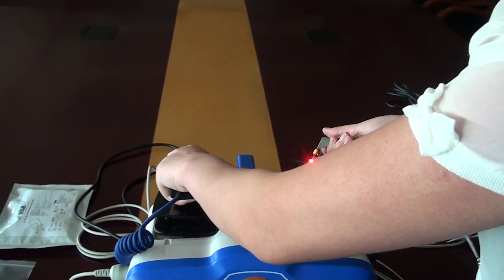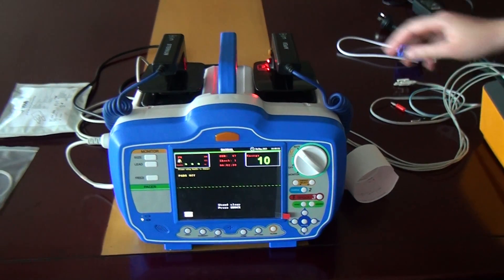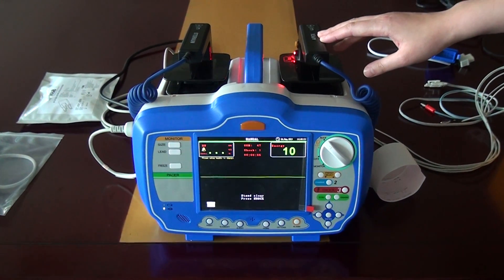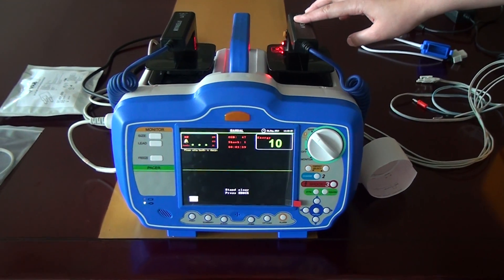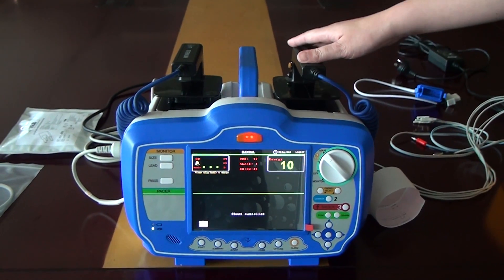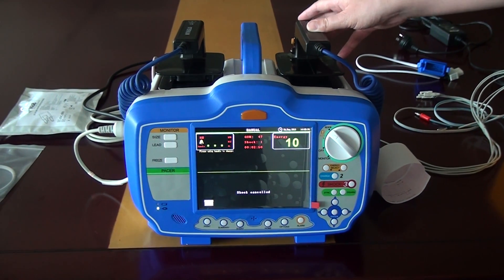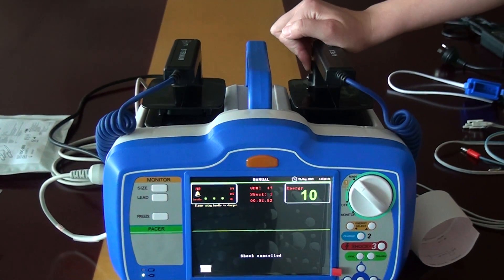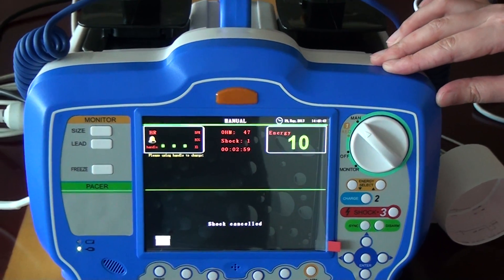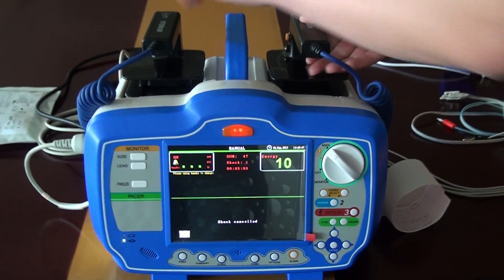If you want to demonstrate, just put it to the device to show. It will display 'shock cancelled', because if you do not press shock within 30 seconds, it is cancelled automatically. You can also press this button to cancel the shock. You must press charge again to recharge.